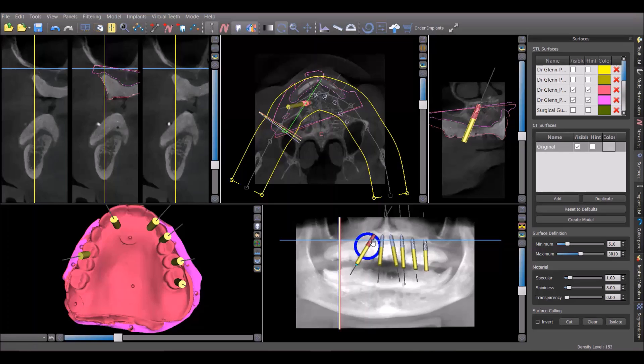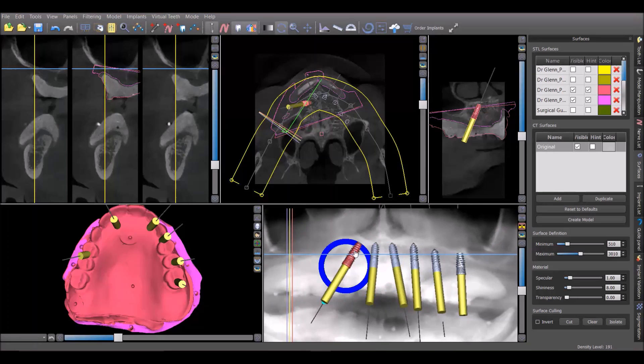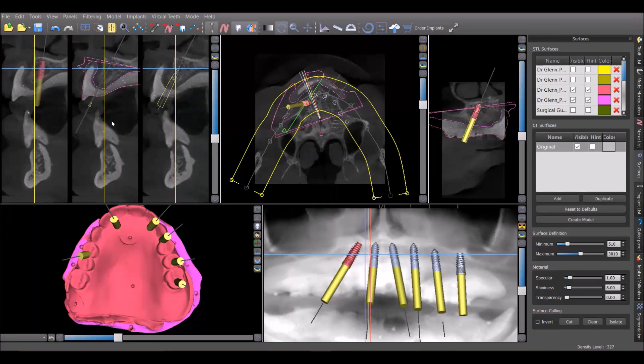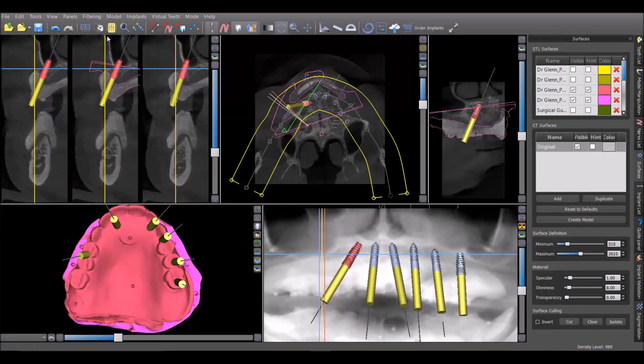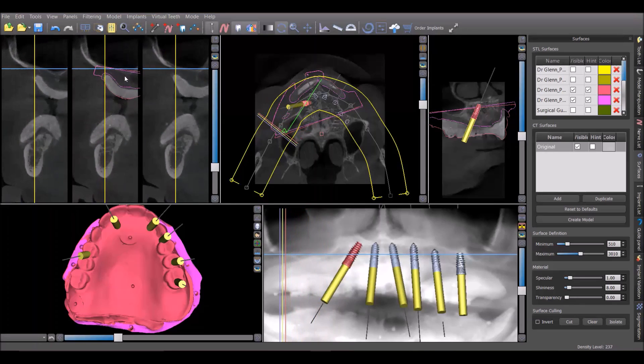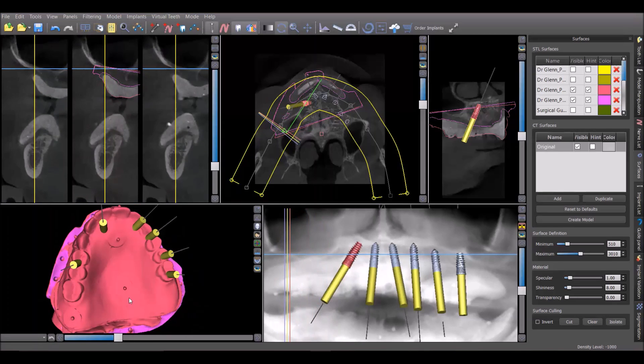We'll go through the implant positions one by one. The first thing you'll notice in this panoramic view is that to avoid the sinus, the implant on the right side has been placed at a pretty severe angle. The reason is there's just one to two millimeters of bone there — eggshell thin. By angling it, we're able to take advantage of the most anterior-posterior spread, and it emerges right through the premolar area, which should be very nice.